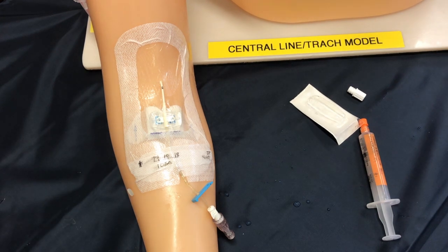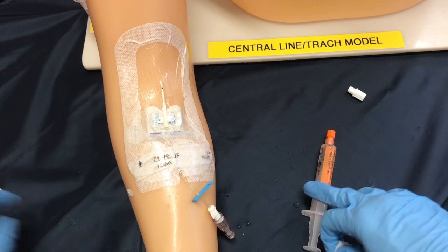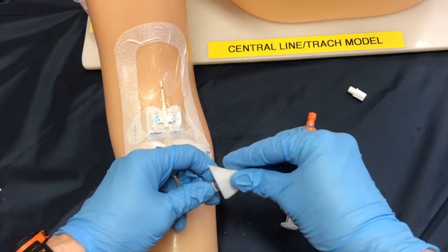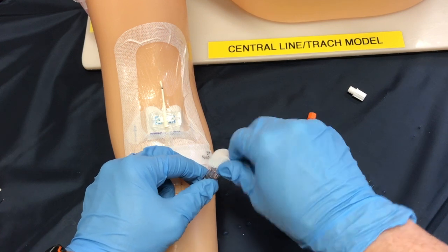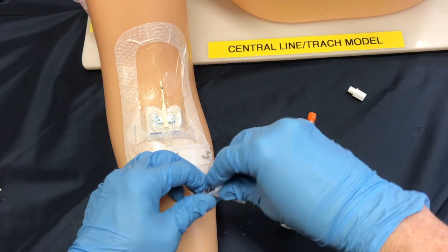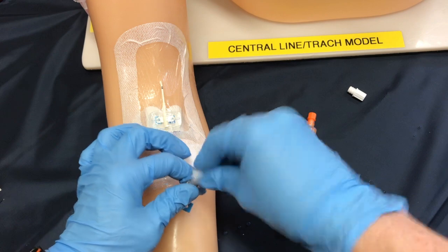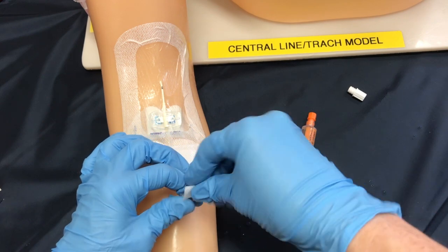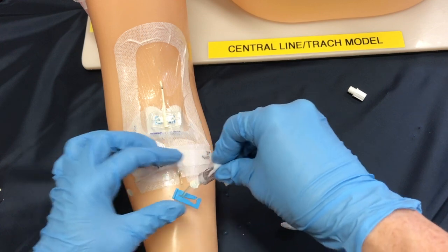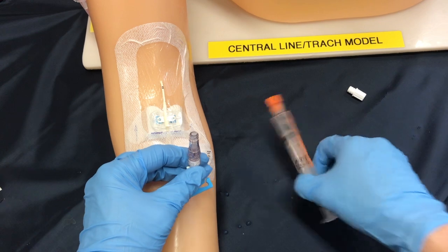There's still one more step — we need to lock the line to make sure it doesn't clot. So again a 15-second scrub is needed here even though we have just put on a brand new cap. Every time we access we need to clean to prevent contamination into the bloodstream, because this PICC line is actually sitting in the superior vena cava just as it enters into your heart. When this 15-second scrub is done, we're going to let it air dry and then get our sodium citrate or heparin prepared.